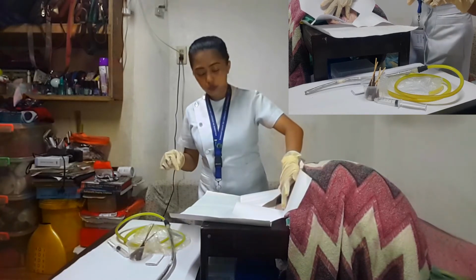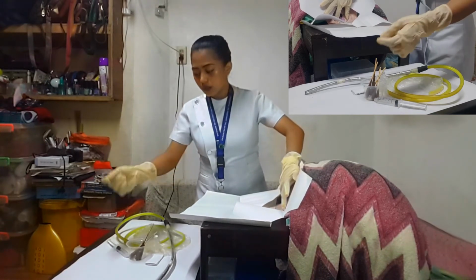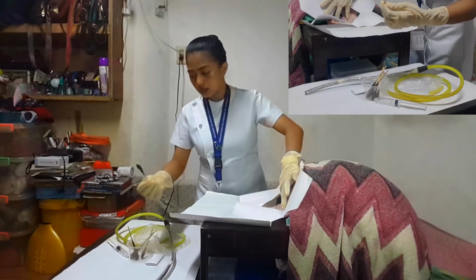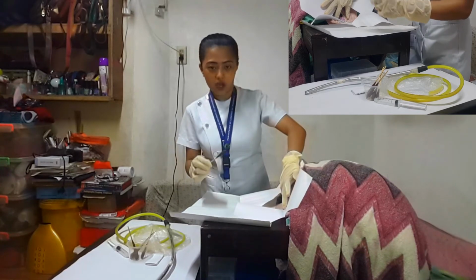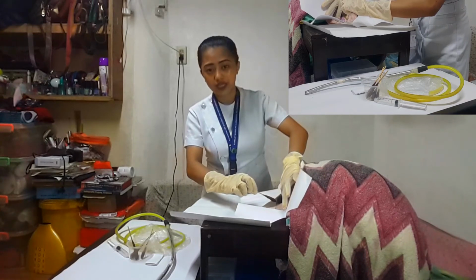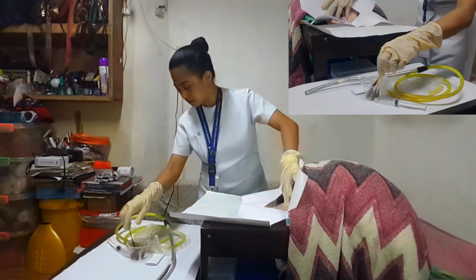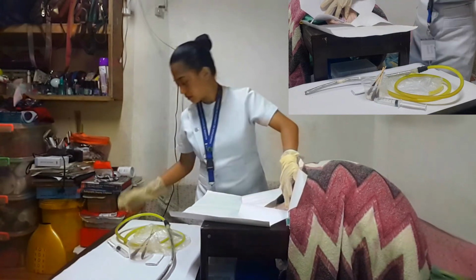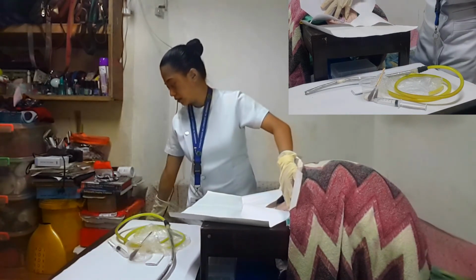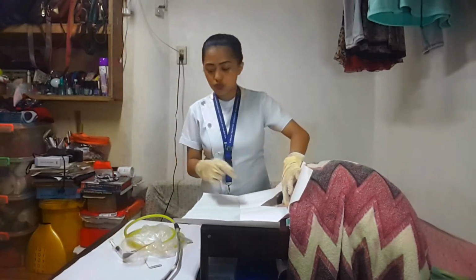Alright? So, after doing that, we need now to get the applicator with betadine, and then wipe it gently but firmly to the meatus so that we will be able to clean before the insertion. Okay, so 1, 2, 3.